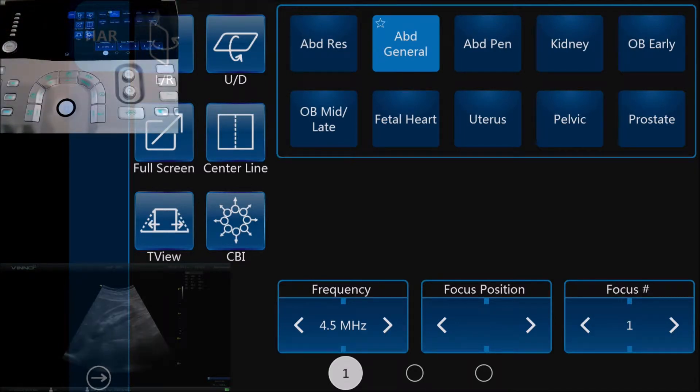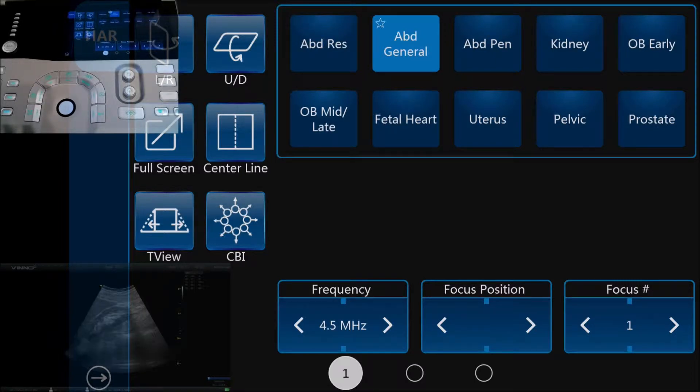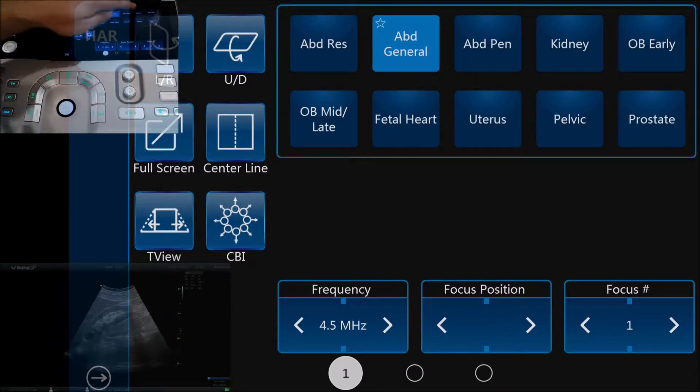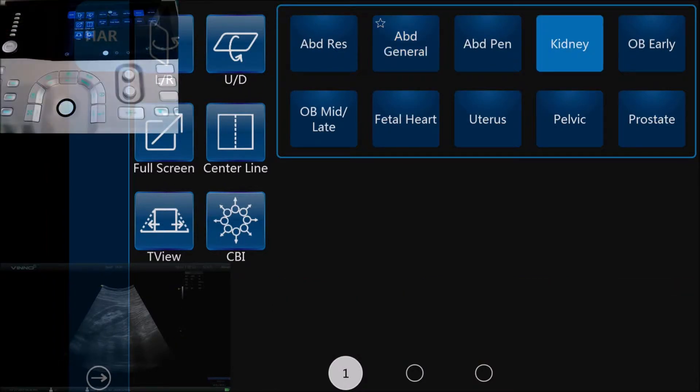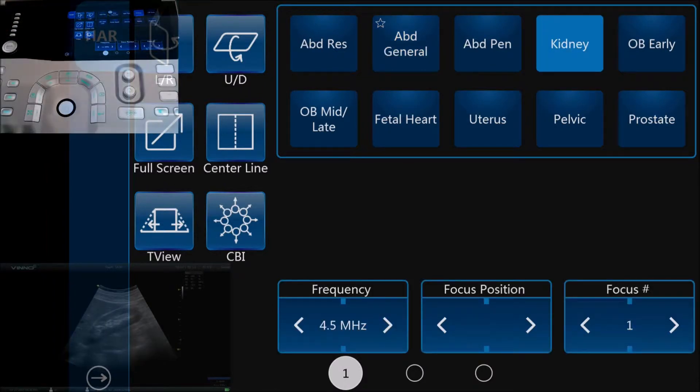In this case we're going to be scanning a kidney, so at the top right here we're just going to select the kidney exam. It's optimized obviously for scanning a kidney.